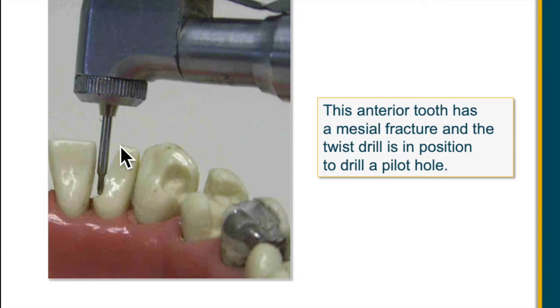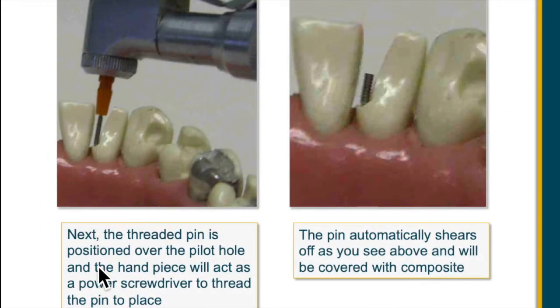So this is the pilot drill. I'm going to make a little hole, and then the pin goes in, and when it bottoms out, it breaks off from the plastic automatically. So the pin remains there.